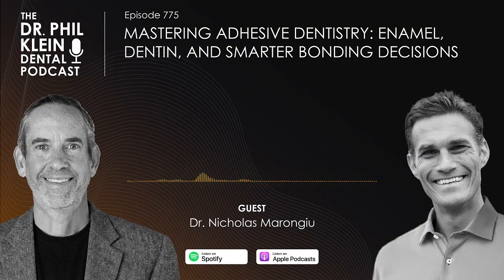The chemistry is important because if you use the bonding agent from one company and a resin or cement from another, the chemistry may not be aligned to have the best outcomes regarding the bond. So I don't ever mix and match. If I'm using Solventum's adhesives, I will only ever use Solventum's composites or cements along with them, because I can ensure the chemistry was chemically engineered to work together. So I eliminate the potential of having some issue where the bond doesn't fully polymerize or there's some chemical interaction that prohibits the full cure or the predictability of the restorations.